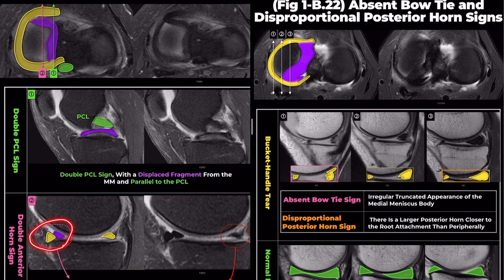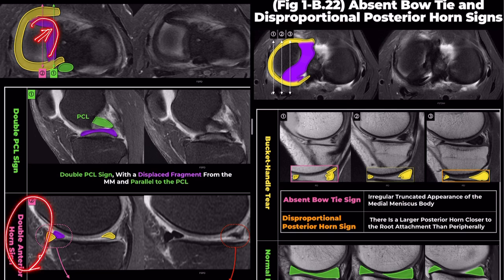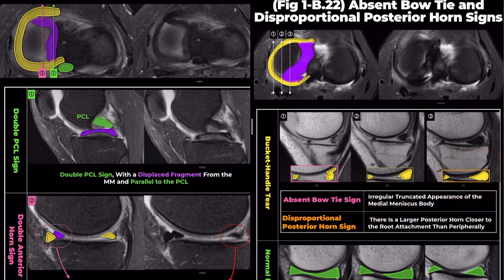When displaced anteriorly, the flipped meniscus exhibits the double anterior horn sign, and when displaced posteriorly, it manifests as the disproportionate posterior horn sign.